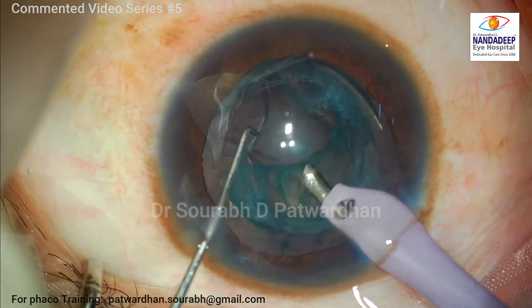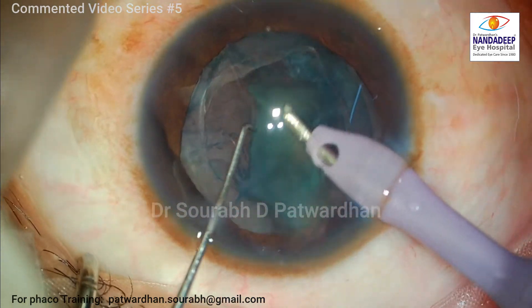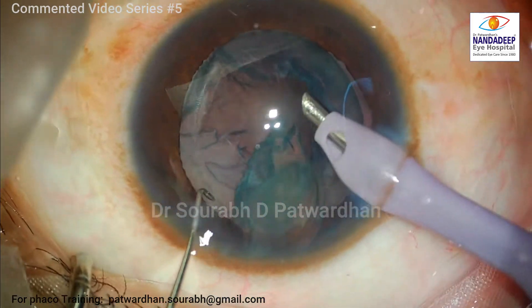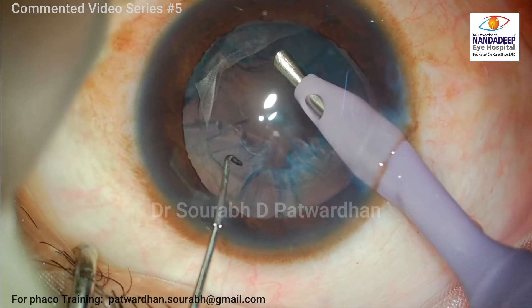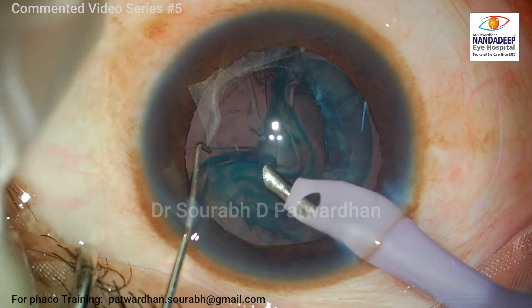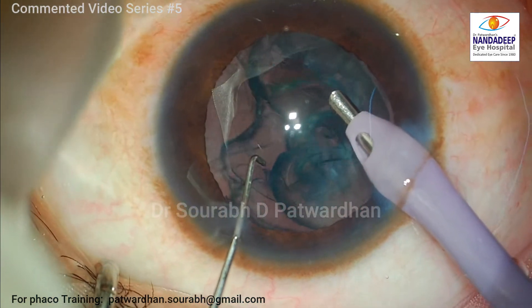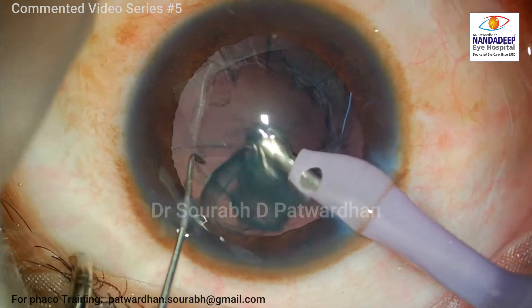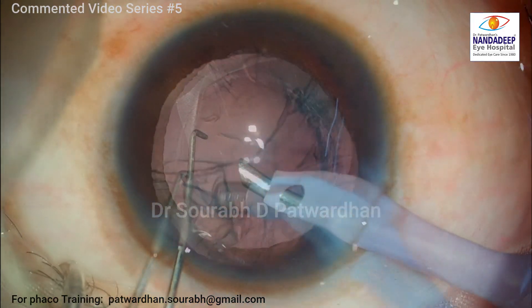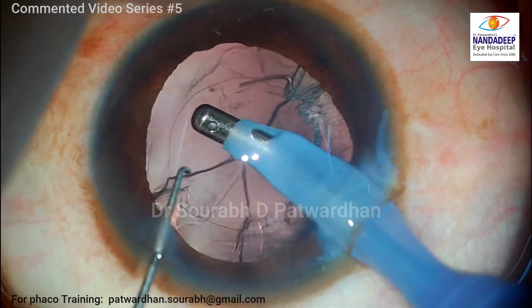Whenever I am entering the eye with the phaco probe and the irrigation is on, I inform the patient that they may feel some kind of pressure sensation. Once the patient already knows what to expect, they generally become less anxious over time. If they unexpectedly experience discomfort, they are more anxious for the future steps.